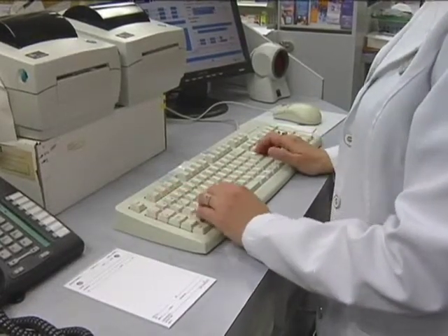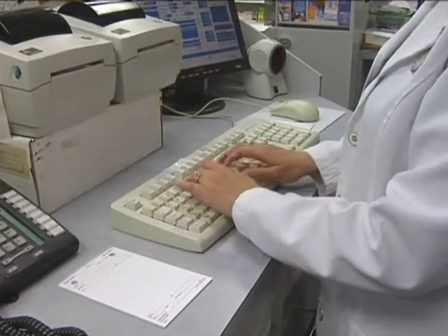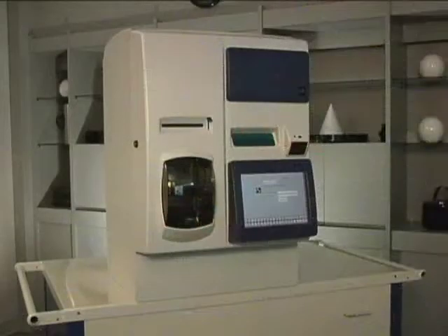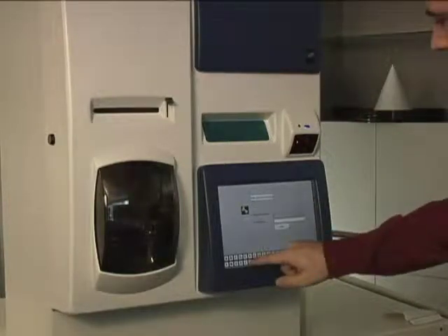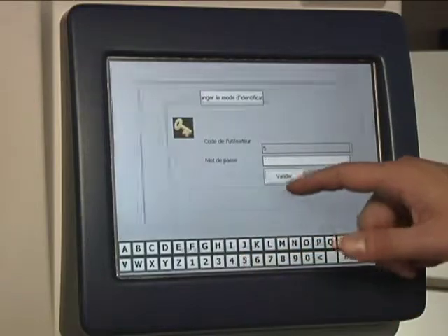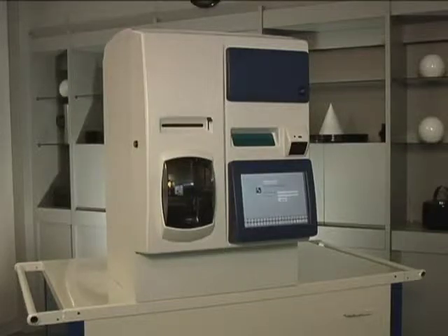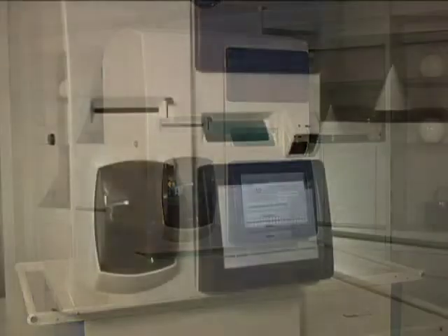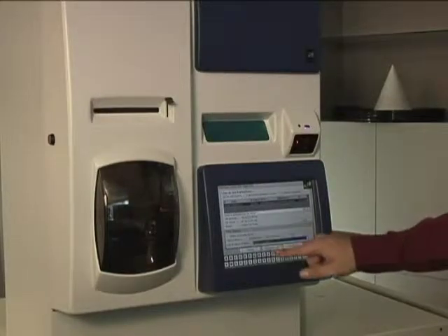Legally, it is only the hospital pharmacist or a specifically authorized person that is allowed to perform the destruction of controlled substances. NarcoMedic manages the return of unused and part-used doses. As before, users must identify themselves so that the system can check that they have the necessary authorization. The type of transaction selected in this case is a return. NarcoMedic holds a database of former transactions, so it is easy to select which dose needs to be returned. The barcode on the NarcoMedic bag is used to identify the doses that are returned into the system.